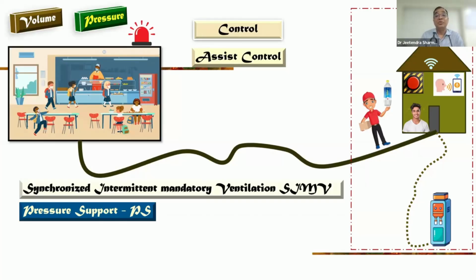Now I am discussing one more mode with this concept. With voice-based command, where you are not physically active, the ventilator can start based upon the voice. So how do I compare this scenario to mechanical ventilation? An electrode is inserted in the esophagus, at the lower esophageal junction where the diaphragm is, and this electrode or sensor can sense the change in electric activity of the diaphragm.